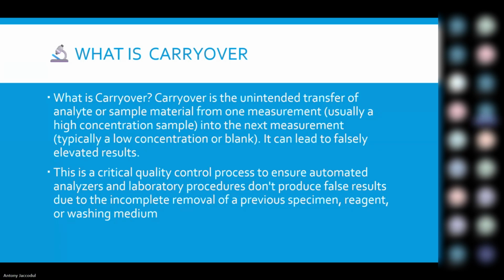Just as the name suggests, leftover, carryover, anything that remains when you have tested one parameter to the other, we normally describe as a carryover. Carryover is the unintended transfer of analyte or sample material from one measurement, usually of high concentration, into the next measurement, typically low concentration, which can lead to falsely elevated results.